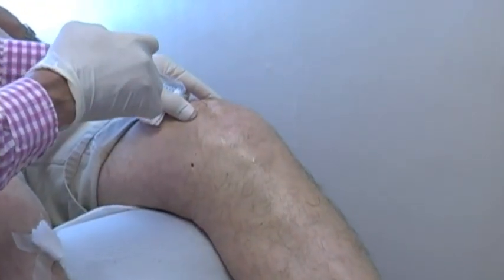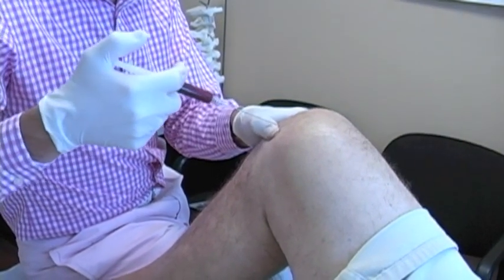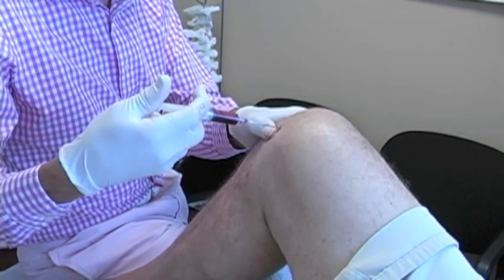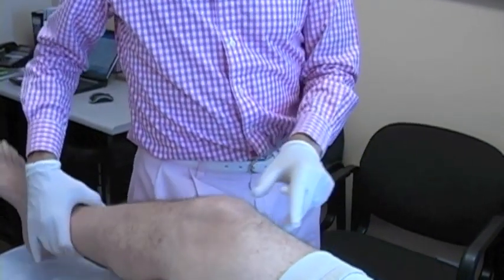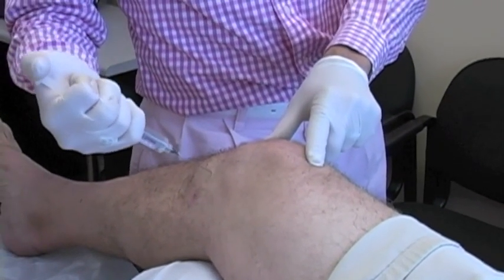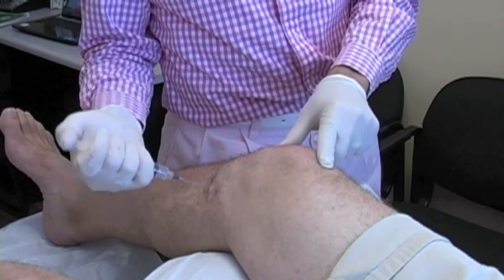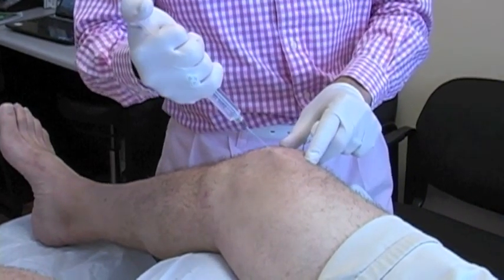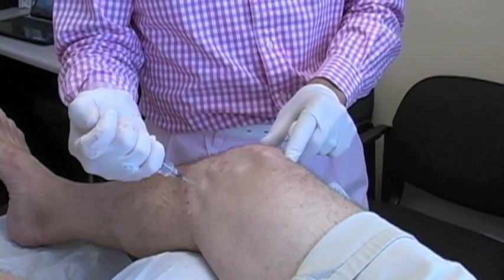As you can see, prolotherapy is done comprehensively. Hackett-Hemwall prolotherapy is done along with the bone marrow lipoaspirate prolotherapy. We're doing the bone marrow lipoaspirate combination intra-articularly inside the person's knee, using the progenitor cells and stem cells inside the knee, while also doing comprehensive prolotherapy to the ligaments and tendons outside the knee to stabilize it. I personally feel this gives better results — you're stabilizing the knee with comprehensive Hackett-Hemwall prolotherapy and stimulating regeneration at a high level inside the knee with the bone marrow lipoaspirate solution.